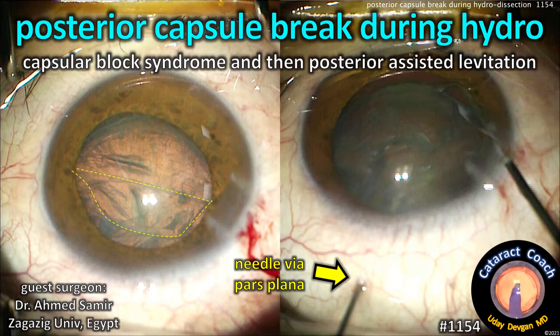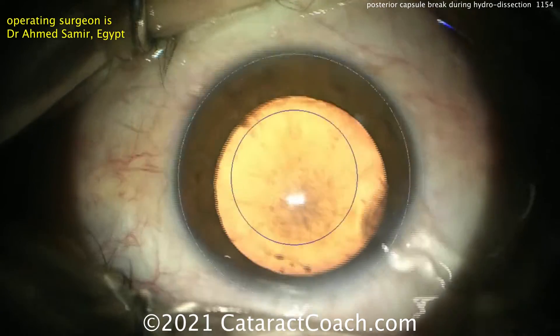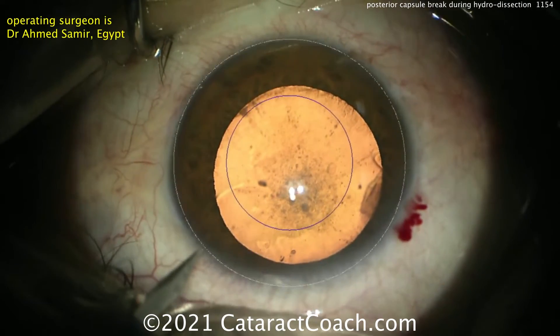CataractCoach.com. Posterior Capsule Break During Hydrodissection. You have a Capsule Block Syndrome which leads to a blown-up posterior capsule and then posterior assisted levitation. Our operating surgeon here is Dr. Ahmed Samir from Egypt, and you can see there's the cataract.